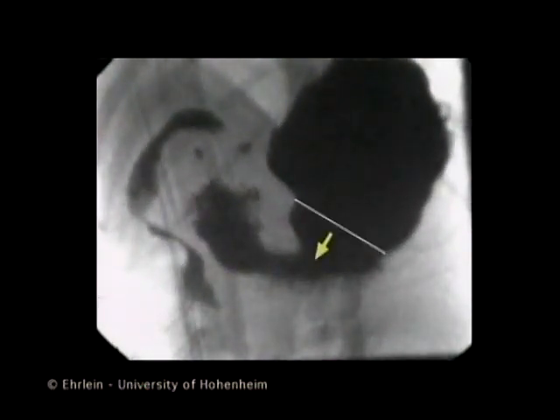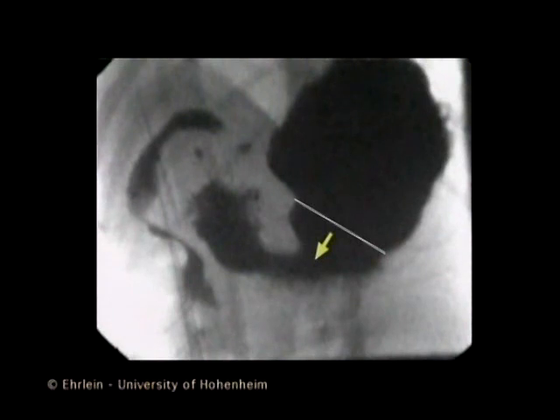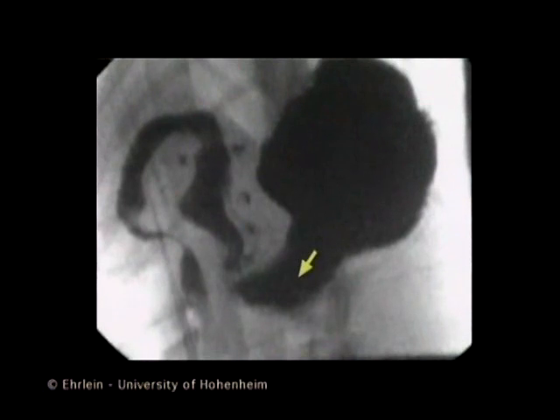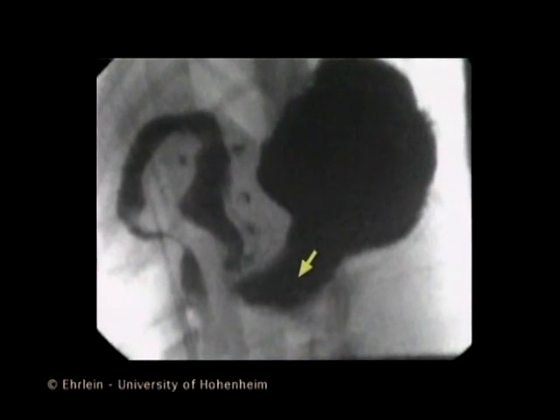A peristaltic wave of the gastric body pushes a bolus of the solid material towards the antrum. The arrow indicates the aboral propulsion of the bolus from the gastric body to the proximal antrum and further distally towards the pylorus.